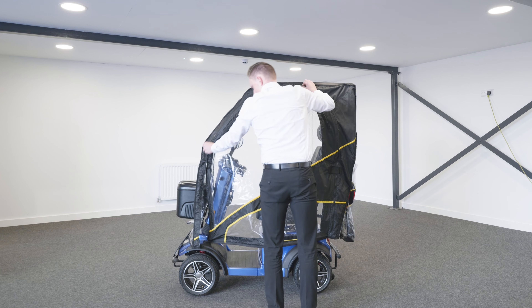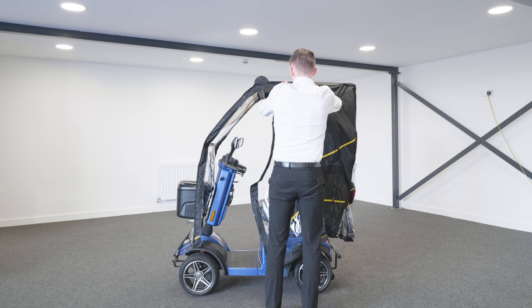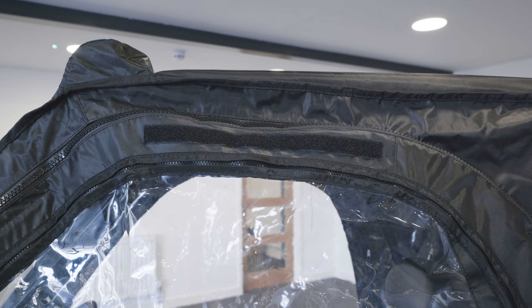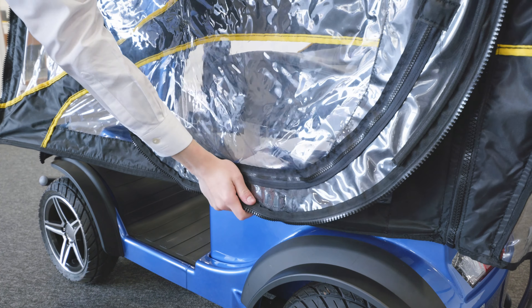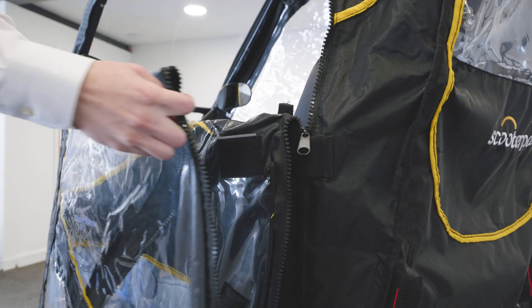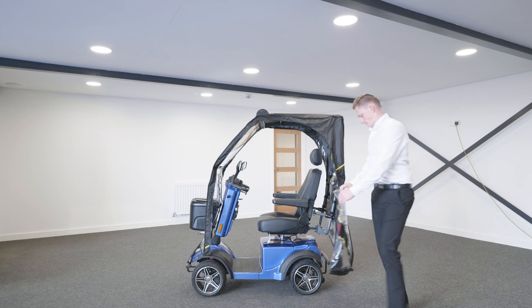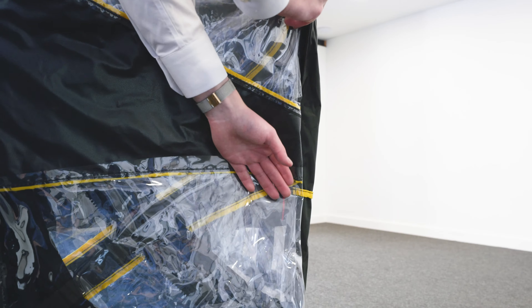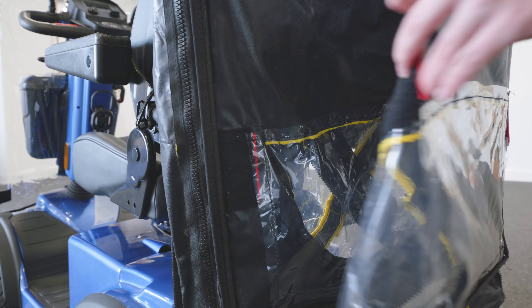To fold away the canopy, simply unzip one side. Fold the door in half and stick the two Velcro strips to each other. Then fold it again in the opposite direction and line up the two Velcro pads. Bring the door back behind the scooter and attach it to the Velcro. Repeat the process for the other side.